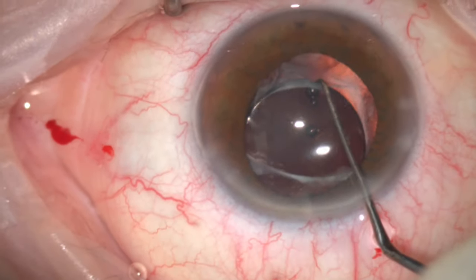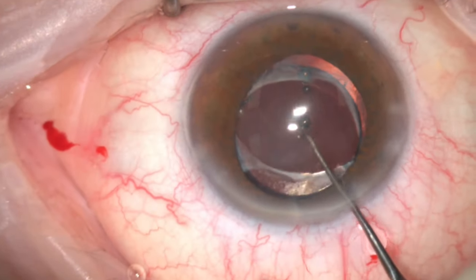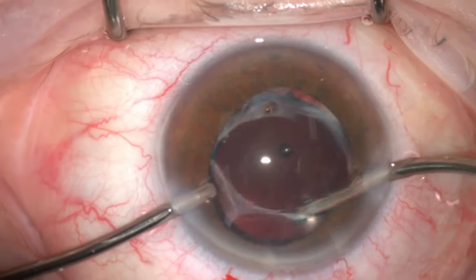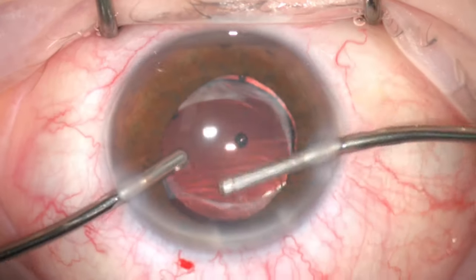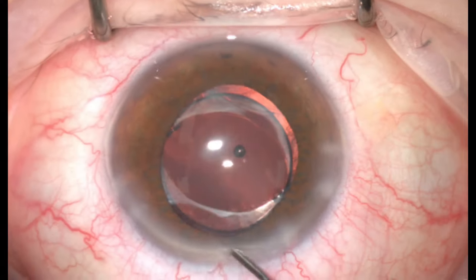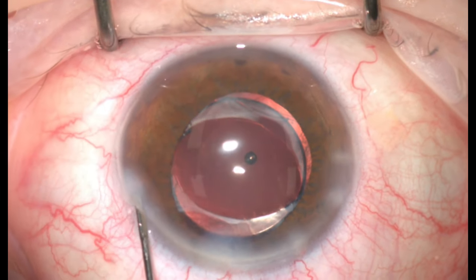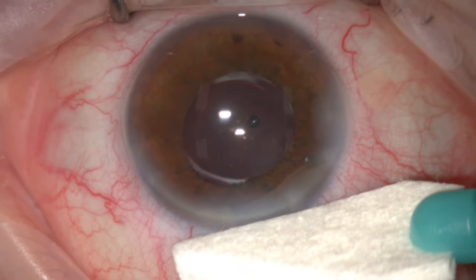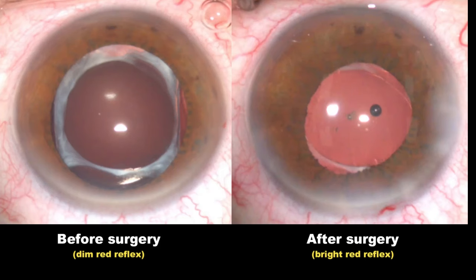Then the optic was captured under the edge of the anterior capsule. This offers better long-term stability for the lens implant and the capsular bag. Further bimanual irrigation aspiration was performed to remove any residual viscoelastic in the anterior chamber or any debris trapped in the angles. Then the main incision and side ports were hydrated and the surgery was concluded. You can notice the difference in the red reflex before and after the surgery.